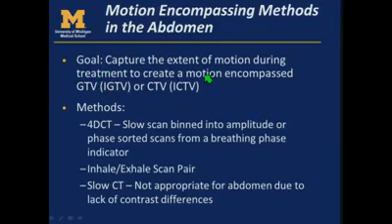ICRU recommendations would be that the ITV is the motion encompassed CTV, but in many places, especially looking at SBRT, where we may not have a CTV, the motion encompassed GTV is what many of us refer to now as the ITV. So in many new NRG trials or RTOG trials, we're switching over to IGTV and ICTV to make it a little more clear.